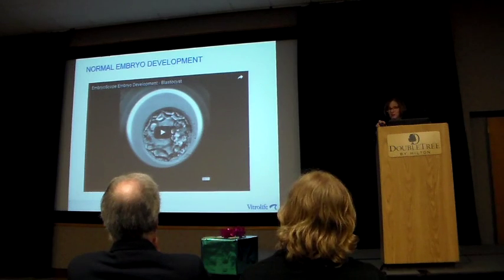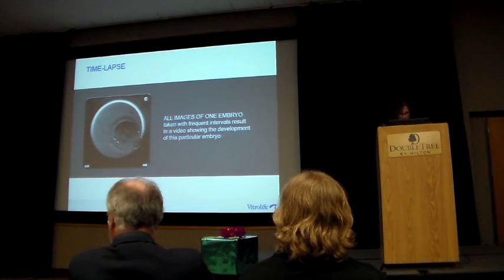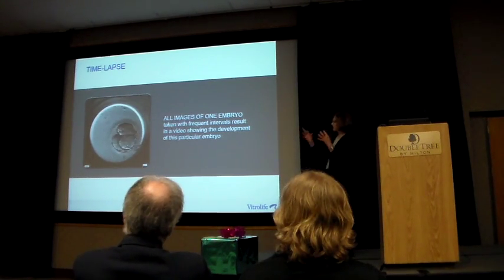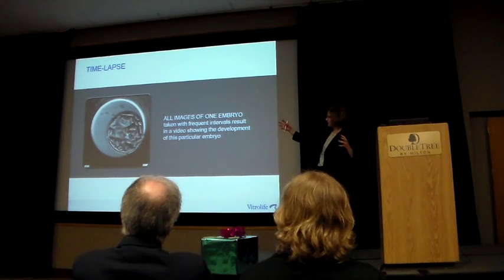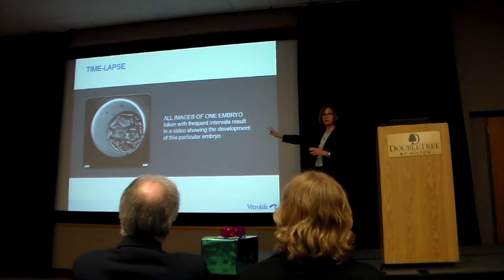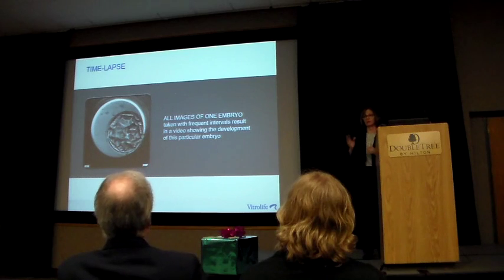So it's a good thing that we got to see the one embryo that was developing normal. We'll go back and watch that one again because there's a couple things I'll point out, if we can. So at normal division, it goes from 1 to 2 to 4 to 8 by about day 3. And then it kind of goes through this organization process and it gets kind of glob-like looking. That's normal, believe it or not. Then it develops into this blast, and that blast kind of expands and contracts a little bit as you're looking at it, and it differentiates into the two types of cells that will become the baby and the placenta. And this would be a normal video.